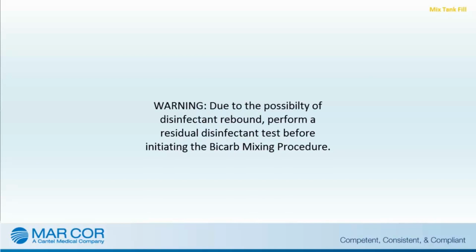Warning: due to the possibility of disinfectant rebound, perform a residual disinfectant test before initiating the bicarb mixing procedure.